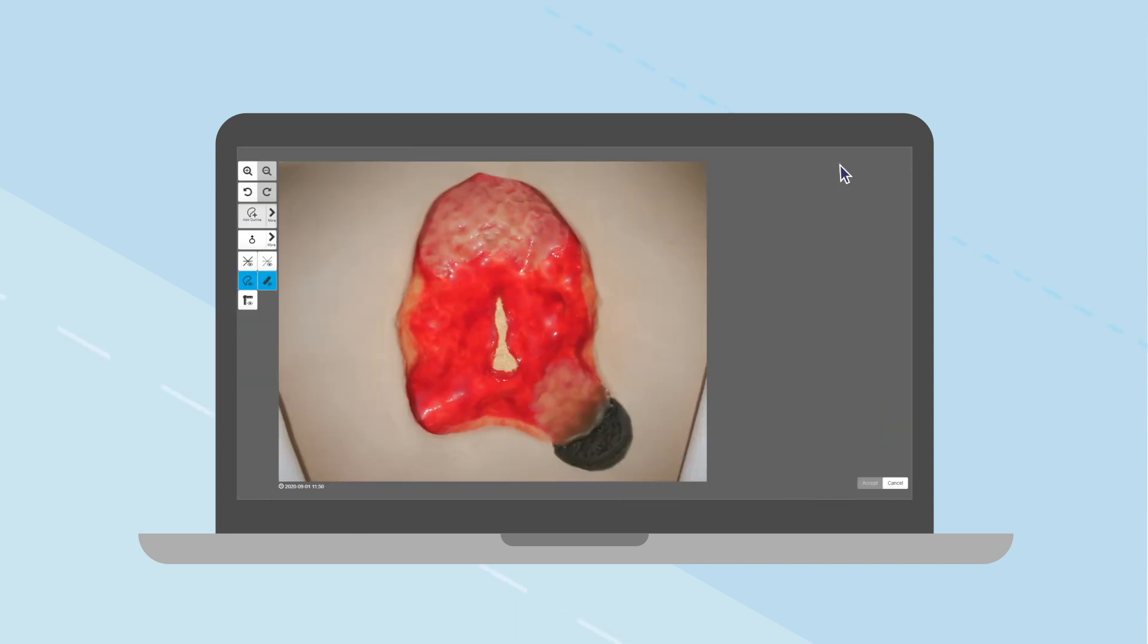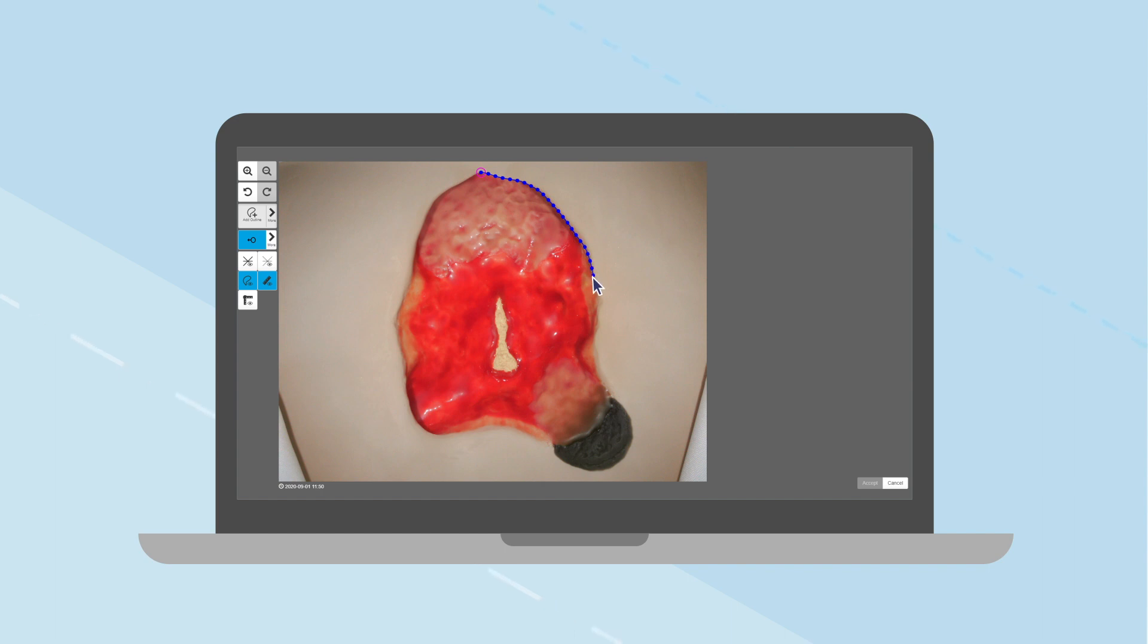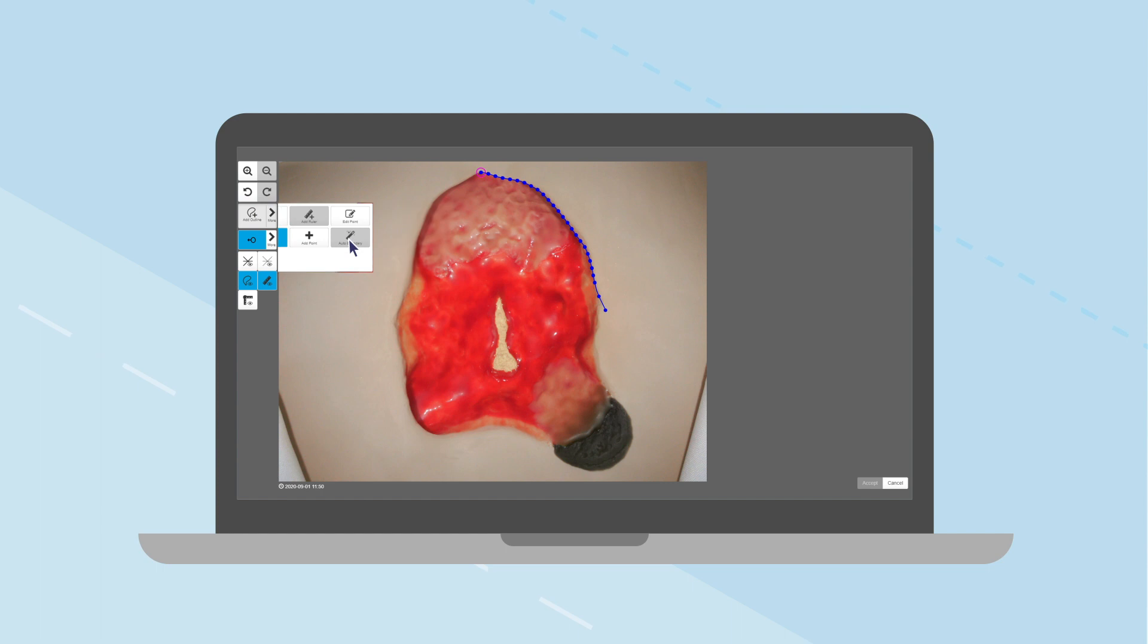The drawing screen enables you to draw a wound boundary and see the measurements. To manually draw the wound boundary, select the Add Outline tool and use the mouse or drawing tools to add points around the edge of the wound. The Delete Point tool removes any unwanted points on the outline. Continue drawing around the wound until you reach the starting point.